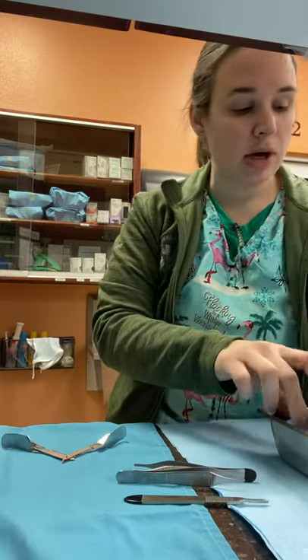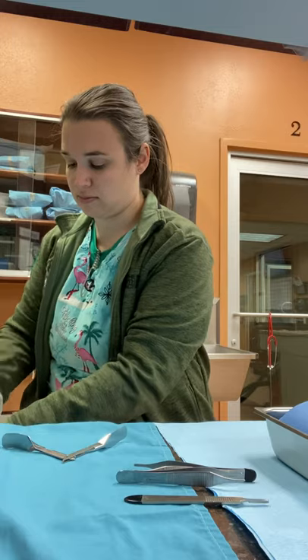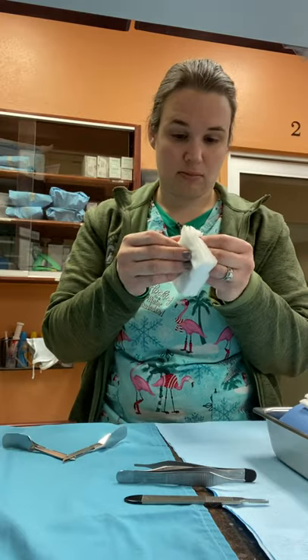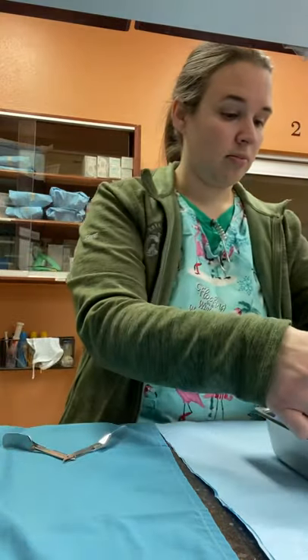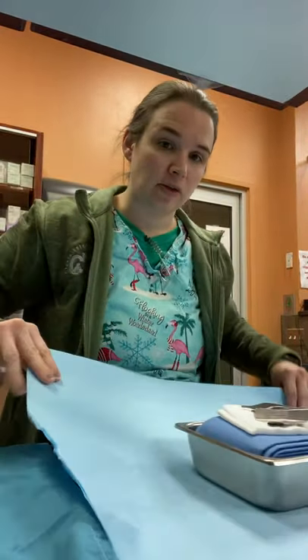Then we will place a large drape over it with our indicator strip and our forceps and blade holder. We also place eight gauze in the surgery pack. This is what our general surgery pack looks like before wrapping. Now we will wrap it — double wrap — in the CSR wrap, put our indicator tape on, and get it ready for the autoclave.